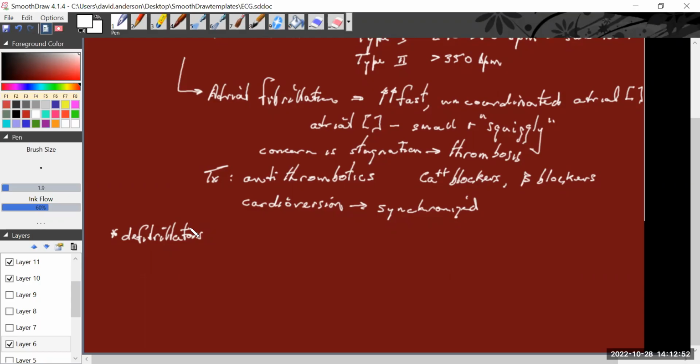So it isn't about sequencing to the existing cardiac cycle. So this one is random, as opposed to synchronized and targeted, we'll call it. So those are a couple of examples of some atrial changes. And we've got some samples that we showed you what they look like.